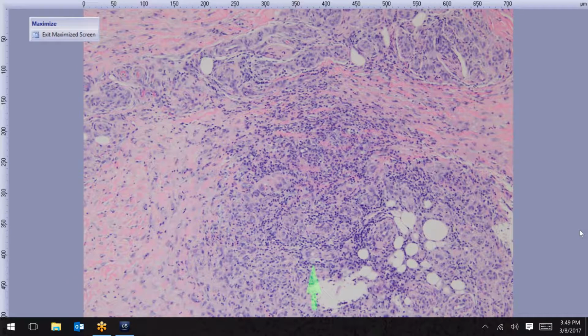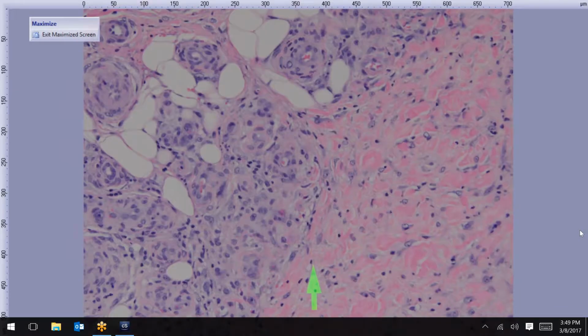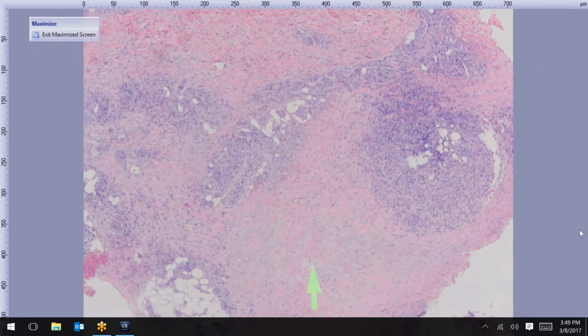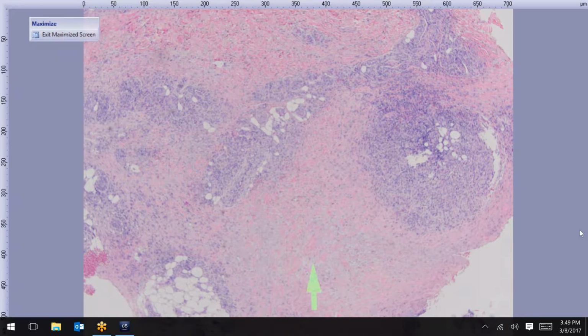And so this is a condition where you can get lymphocytes, histiocytes, multinucleated giant cells. You can even get some neutrophils and eosinophils in here sometimes. So anybody want to venture a diagnosis? That's correct, EN, I think somebody at UIC said. So yeah, this is a nice classic case of erythema nodosum. So septal thickening and septal panniculitis with maybe some spillover into the lobules.